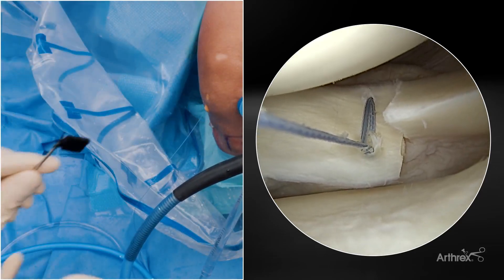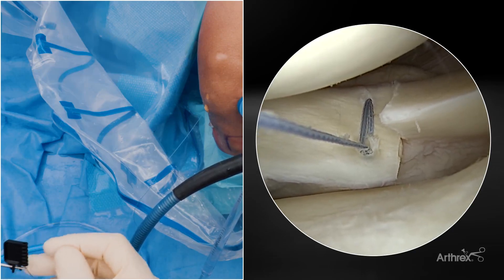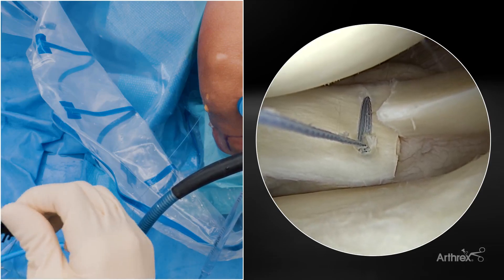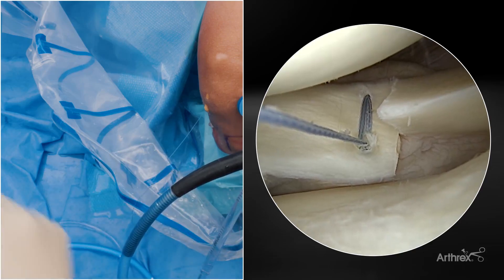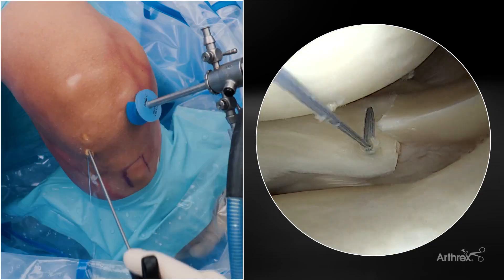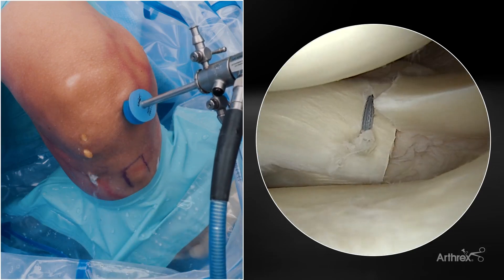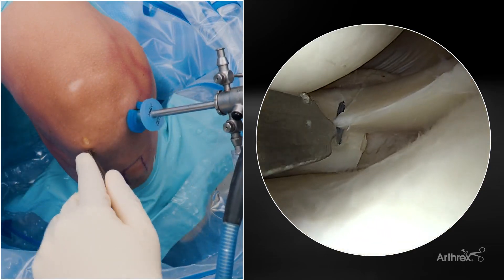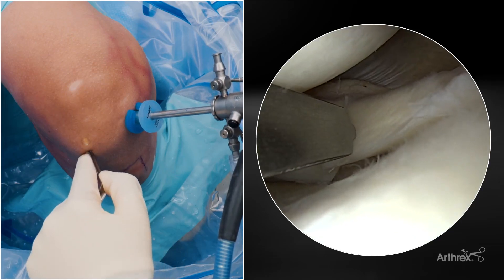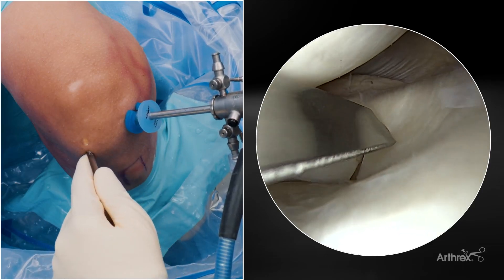For these ripstop sutures, they do not need to compress the meniscus significantly against the capsule. They're purely providing our biomechanical ripstop for our horizontal mattress sutures. We'll come in for our second ripstop suture — you can see here the atraumatic tip on this guide can help us reduce the meniscus and assess our positions.